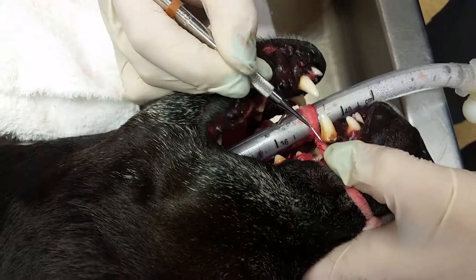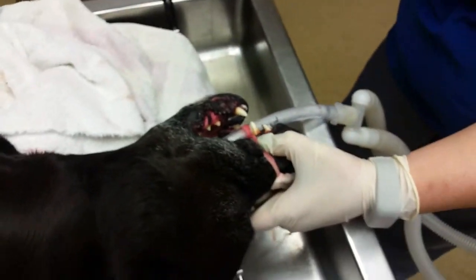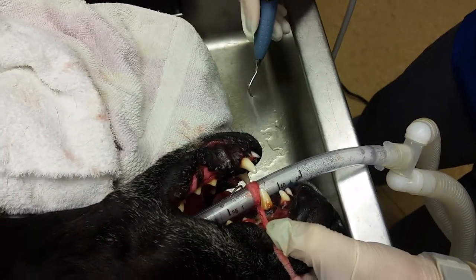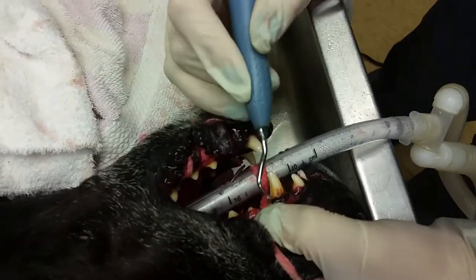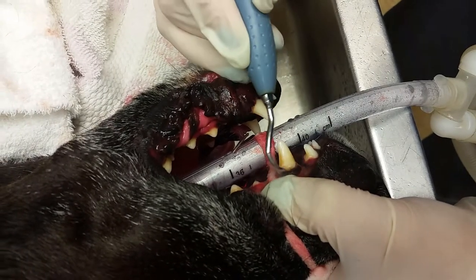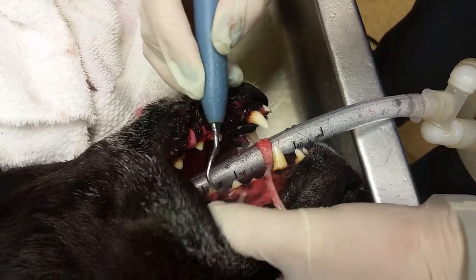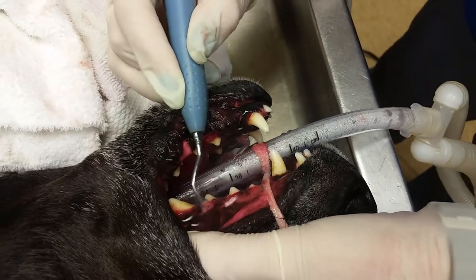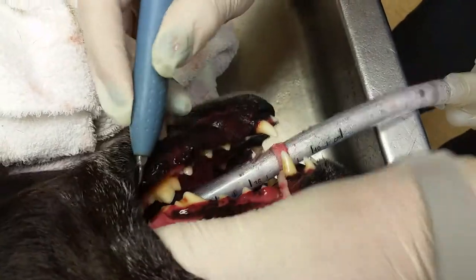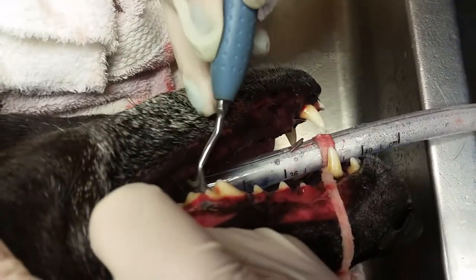A better way, and what we usually do for most of these, is just the ultrasonic cleaner, which I'm going to show you how to use now. This is the ultrasonic scaler. I want to test it, make sure that the water is flowing through — and it is. It's got a nice sharp point to it, and then I'm going to go ahead and scrape the tartar off. I never want to stay longer than about two seconds on the tooth, and I want to move back and forth along the whole jaw for each tooth, making sure I'm getting that tartar off without heating the tooth from doing too much at one time.